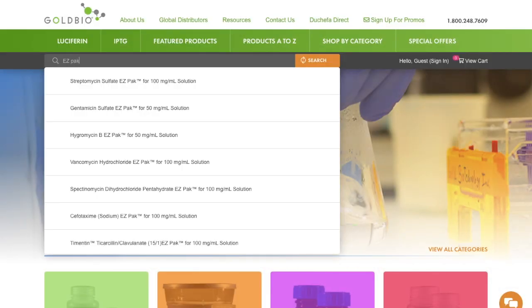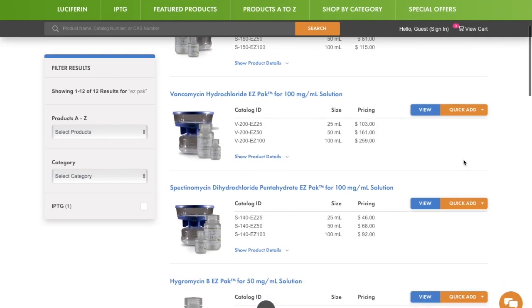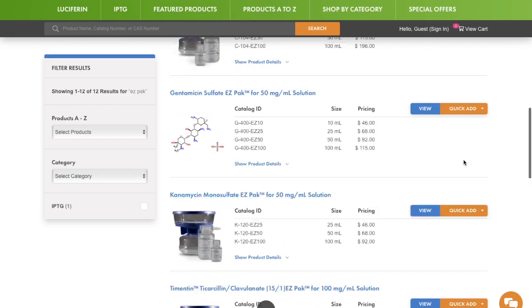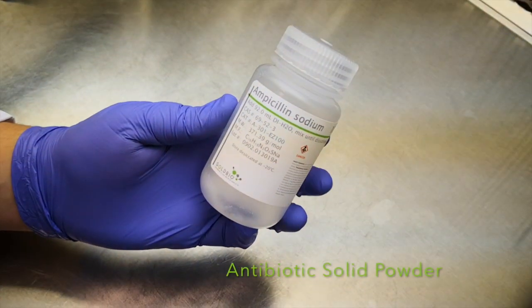Our larger easy packs come in volumes to make 25, 50, and 100 milliliter solutions. They all include one bottle of pre-measured antibiotic powder.